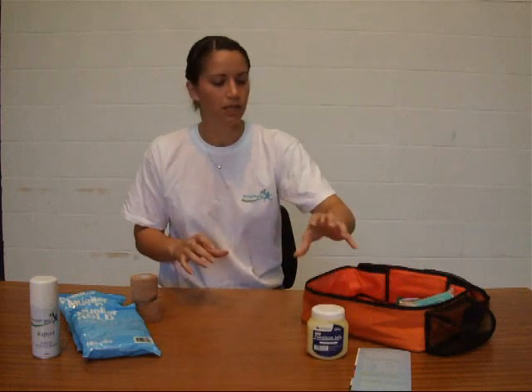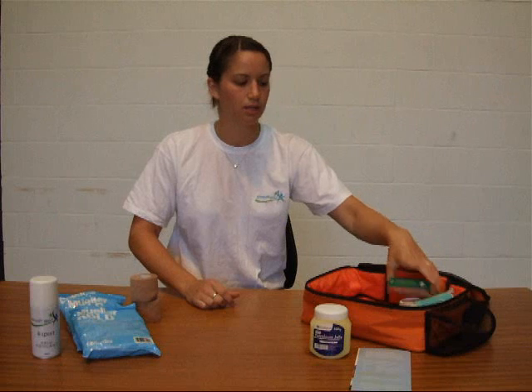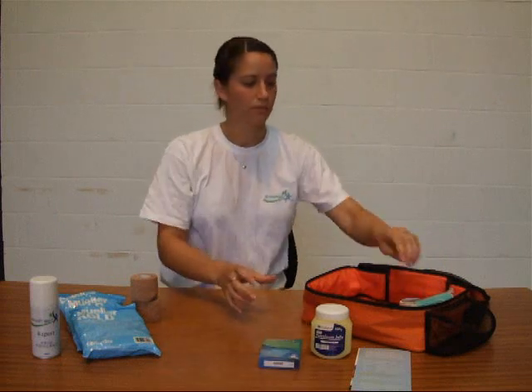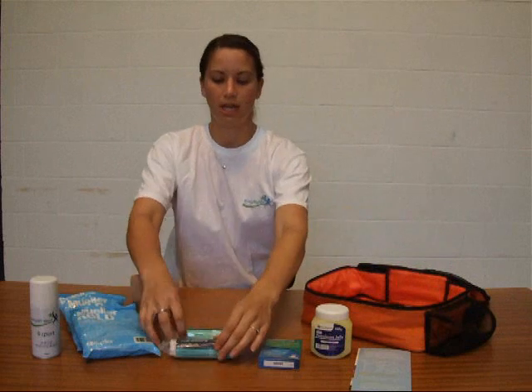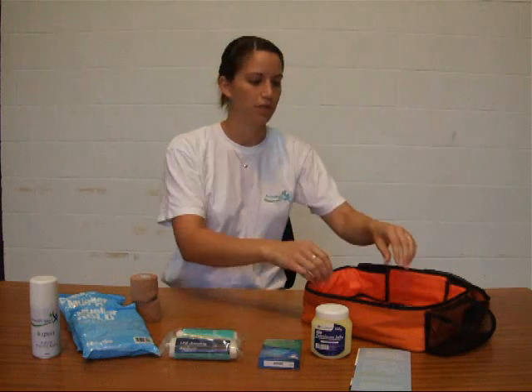We've got some petroleum jelly, or Vaseline as some people call it, great for applying onto wounds just to stop them bleeding before you put a dressing pad on, or for any friction or blister forming. Blister plasters, just to put on once those blisters have formed. We've got some medium dressings — a 12x12 dressing pad with a bit of bandage on each side, just to apply on, wrap round, and straight back onto the pitch again.